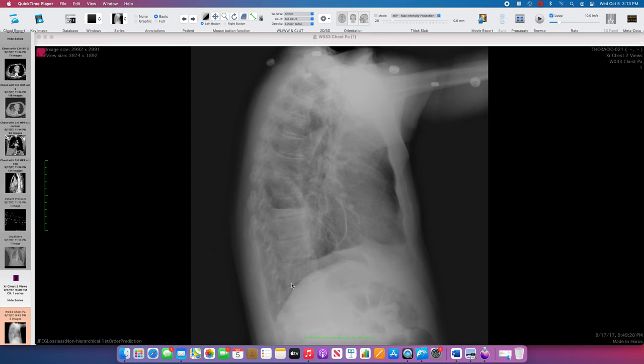This is telling us that there is some sort of process in the lower thorax, posterior lower thorax. Commonly that'll be a pneumonia, but really anything that increases the opacity can create this finding. And again, that well-defined linear border.